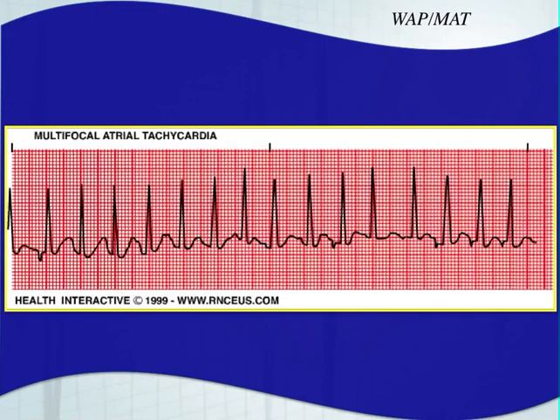Here's another example of multifocal atrial tachycardia. Remember WAP — wandering atrial pacemaker — looks exactly the same, it's just slower than 100 beats per minute. Now you might be saying you don't see P waves over here, and you're right — you can't see them because the rhythm is too fast. But you do have a P wave here — it's in that T wave, we talked about that before. The same thing happens here — that extra bump in the T wave is the P wave. The fact that this is so irregular indicates this is possibly a multifocal atrial tachycardia.